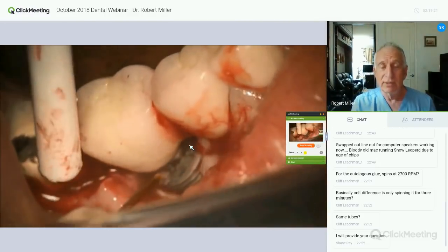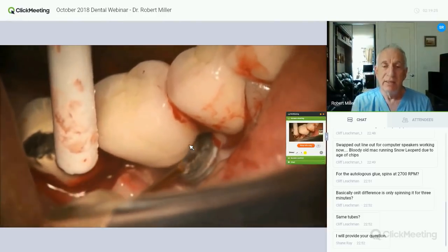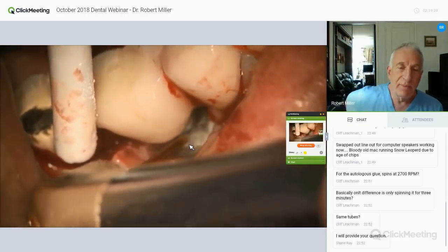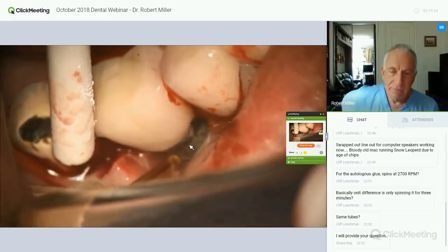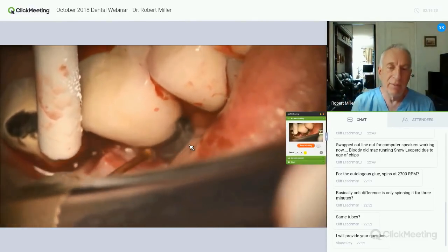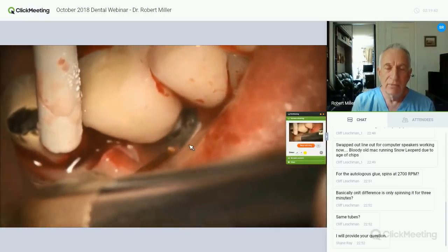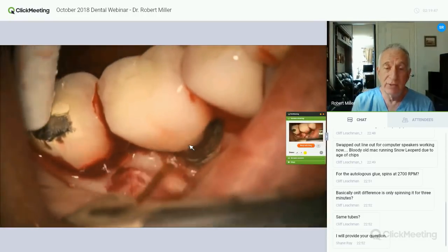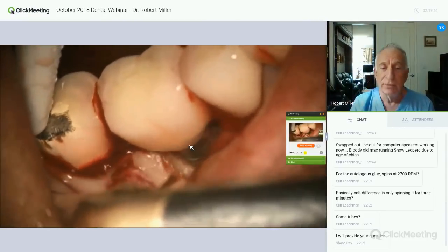On these roughened surfaces, I find again that my best instrument for this is, in fact, an ablative laser. In 2004, we published a paper in the Journal of Oral Implantology that shows how effective, on a scanning electron microscope study, we were able to surgically debride these. This is the I+ from BioLase. Then we're going to graft this as soon as I'm finished removing any trace of this granulation tissue.